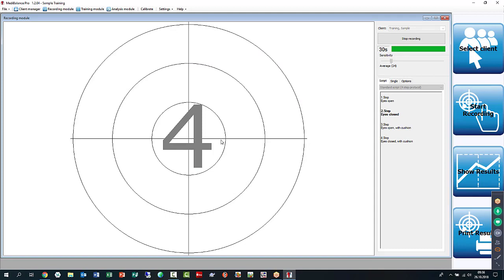So client stands on the platform, closes the eyes, and if you have somebody who uses the eyes to hold on, you will see a lot of movement. I'm creating a lot of extra movement now so that we get a pathological finding, somebody who's not stable here. And so this client is missing the help of the eyes and hence going rocking back and forth with it and creating more movement than there should be.